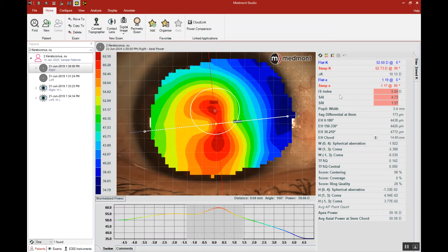The difference here is this patient would need an incredibly specialized lens to account for this high rate of corneal flattening. It may be likely that we'll need a steep central base curve in a corneal GP with a very aggressively flat peripheral curve system, to account for this high eccentricity and this high rate of change toward the periphery. Our contact lens must account for this significant shift in curvature between the center and the periphery, and this is why these irregular corneal patients often need specialty contact lenses.